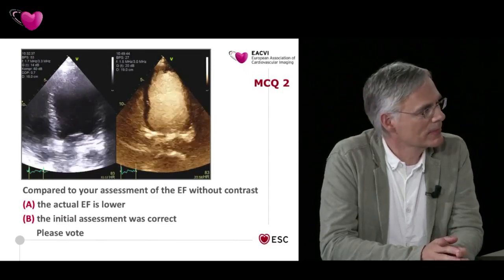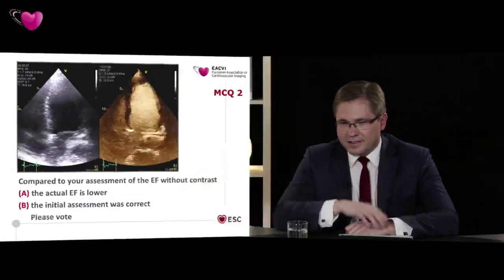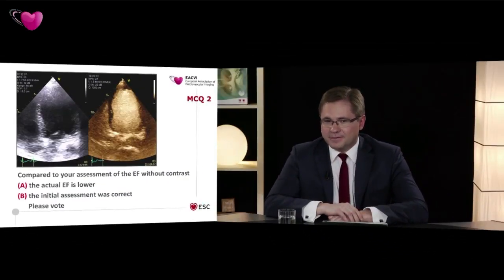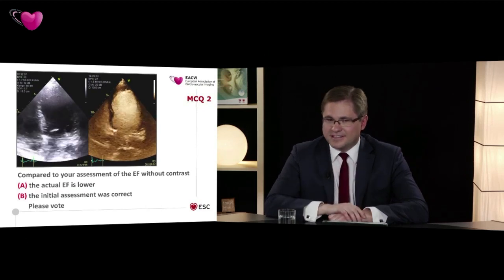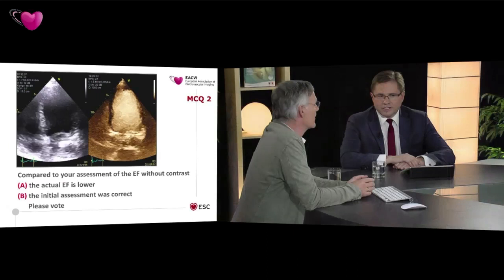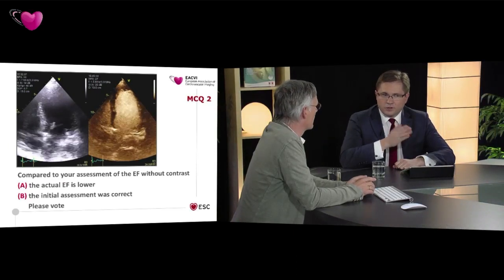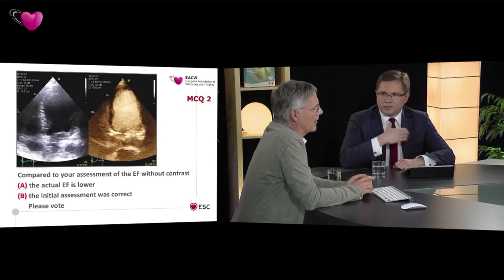I think this will be a short vote, but I also have a short question. Because you have shown the contrast image straight away, but of course it takes some time to get an IV line. So my question is, in your daily routine practice, do you obtain written consent before you perform contrast echocardiography, or do you treat it as an inherent part of echocardiography and you just put an IV line, and when you need contrast, if you need contrast, you inject it?